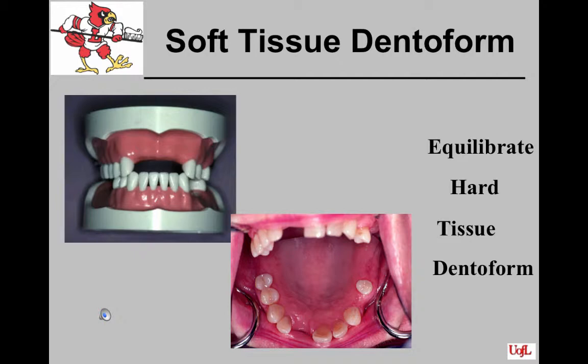If the patient does not have many teeth that intercuspate well, and the patient wanders from one position to the other when you ask them to bite down, then you would possibly consider centric relation position and do an occlusal adjustment to make maximum intercuspal position and centric relation the same.